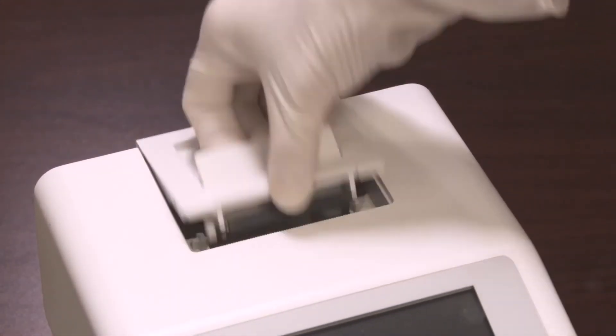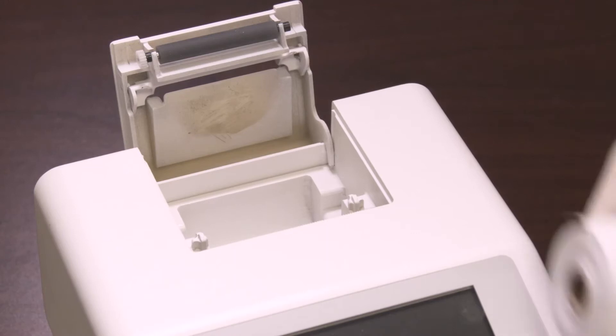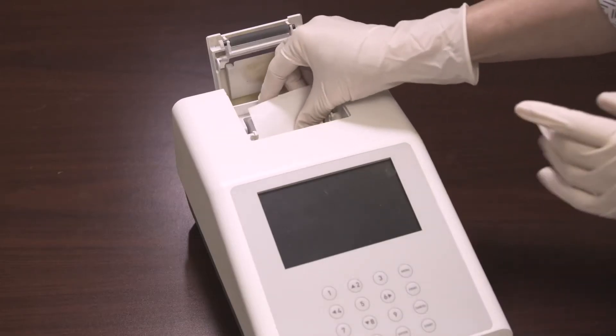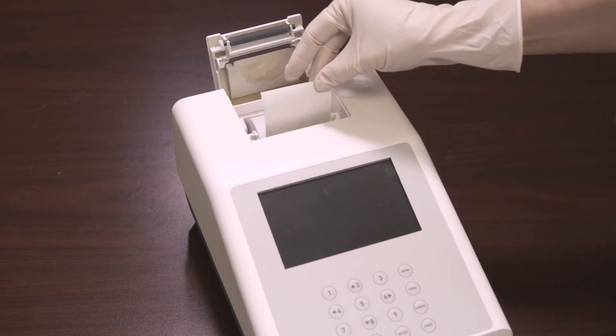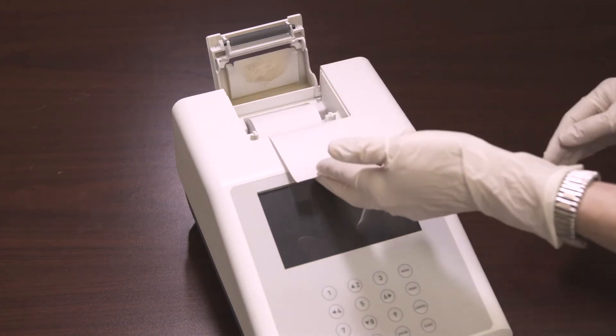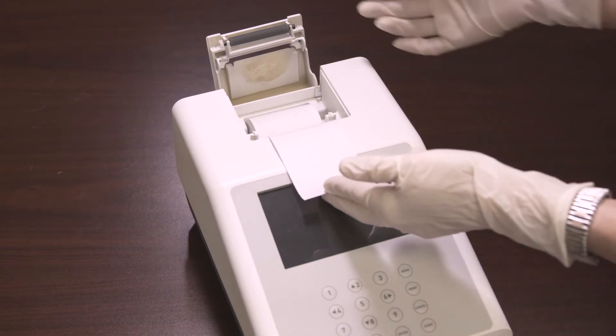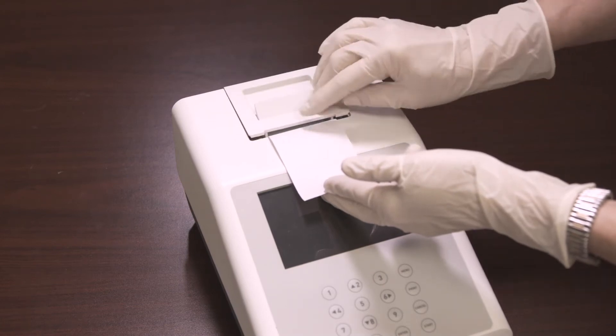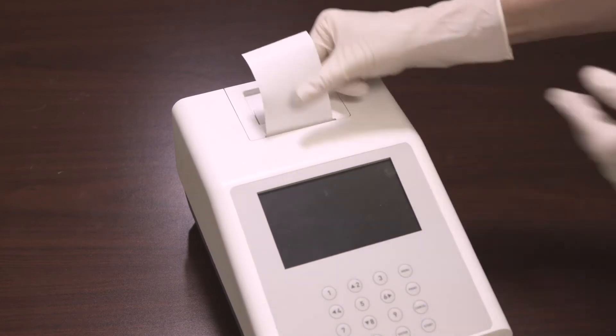To load the printer paper into the internal printer, open the printer cover by pulling up on the tab. Place the new paper roll into the printer paper compartment with the paper unrolling from underneath and towards the compartment wall. Pull about 4 inches or 10 centimeters of paper past the top edge of the paper compartment. Return the printer cover to its original position and snap it firmly into place.